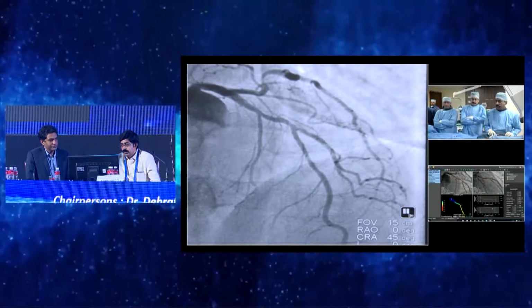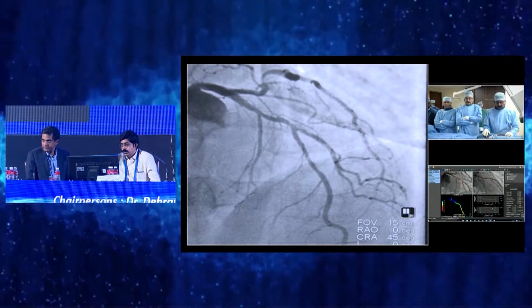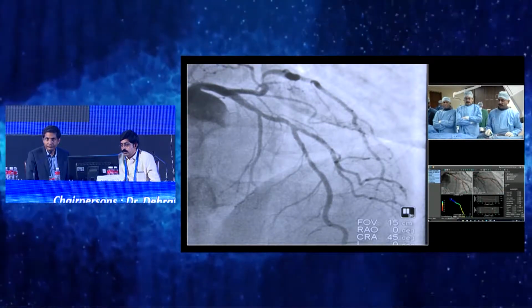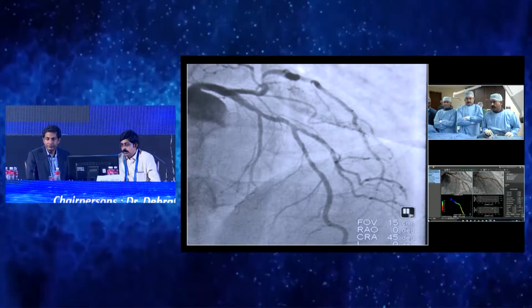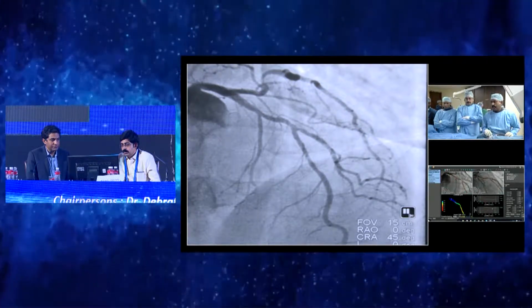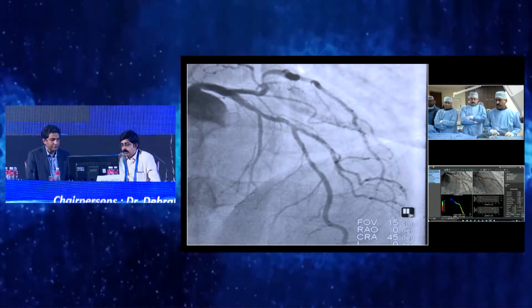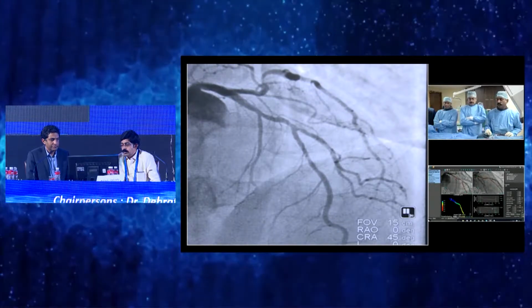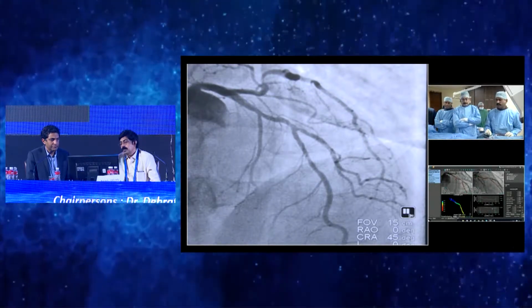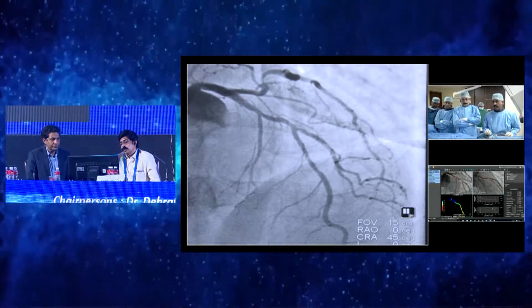Thank you, Dr. Khanna. Actually, we requested Dr. Khanna to come and perform a good peripheral case, but we had to change, and we decided to do a multi-vessel PCI, which he has explained. If you see, we appreciated that LAD lesion, which looks like a long segment at multiple places. How many of you feel it could be important, especially at the septal point just above the diaphragm, where it looks a little more significant, and another point in the caudal views?